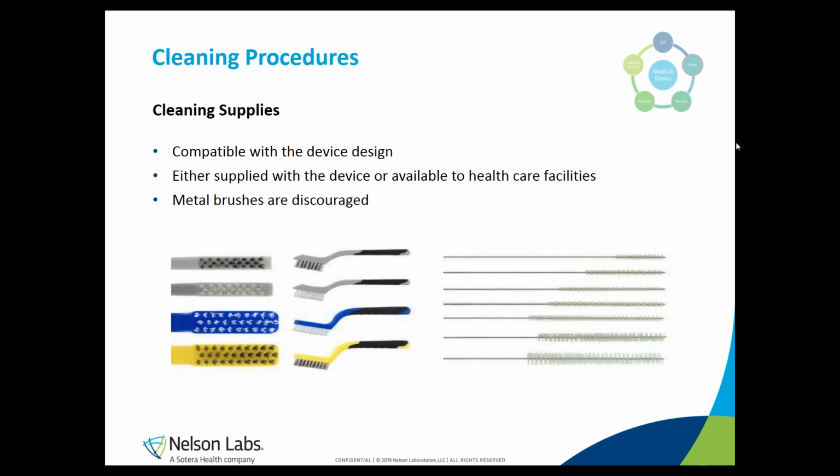Also, especially when manual cleaning steps are involved in a cleaning procedure, the cleaning supplies that are used can be very important. These supplies should not only be compatible with the device. For example, it should be possible for the chosen supply to clean difficult to reach regions when used for that intention. But it also has to be easily available for a healthcare facility. Sometimes specific cleaning supplies can even be provided together with the device by the medical device manufacturer.